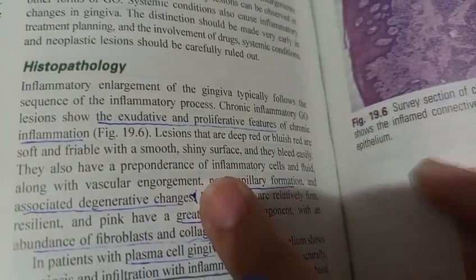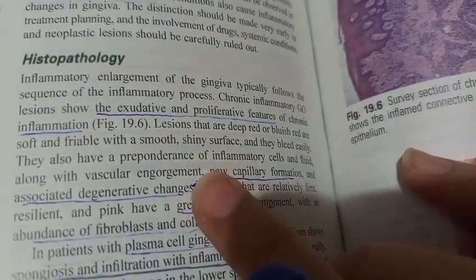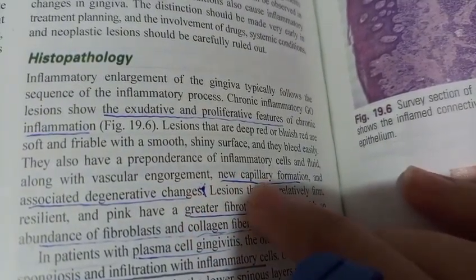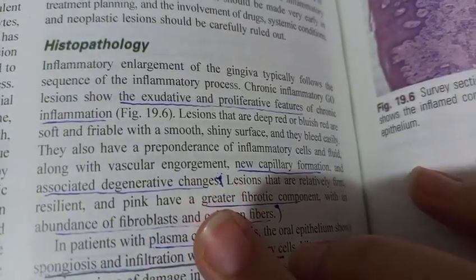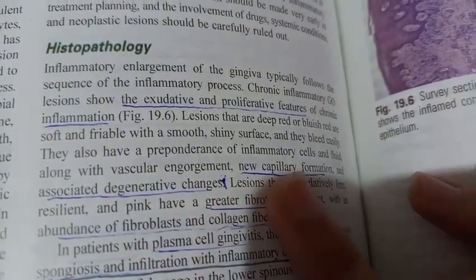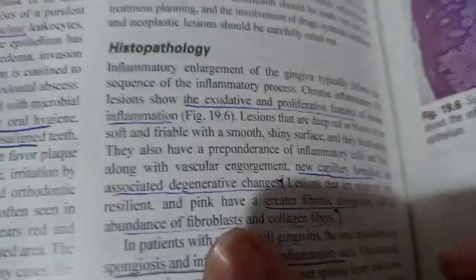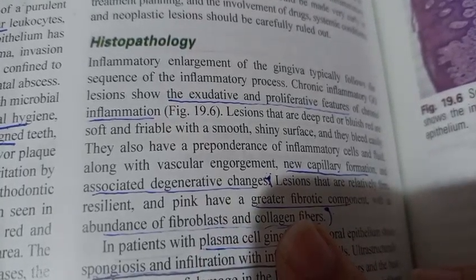Then they will have a preponderance of inflammatory cells and fluid with vascular engorgement, and you will see capillary formation and associated degenerative changes. You will also have lesions with a greater fibrotic component and abundance of fibroblasts and collagen fibers, because we know that fibrosis is responsible for gingival enlargement.